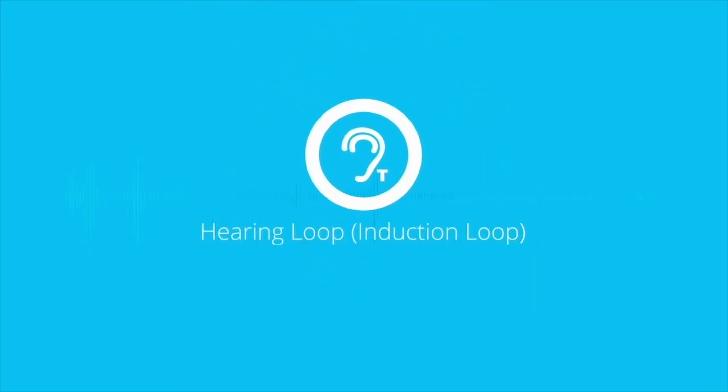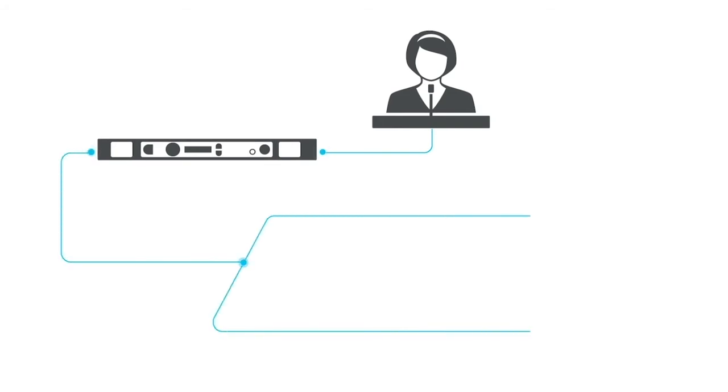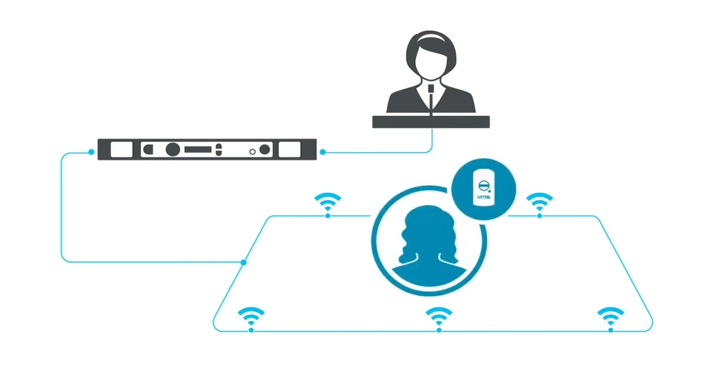Induction Loop, also called Hearing Loop, is a technology that dates back to the rotary phone, using a magnetic signal that travels through a loop of wire cable surrounding the perimeter, transmitting to anyone whose hearing aid includes a telecoil switch. It's important to note that induction loops only work with hearing aids equipped with a telecoil, a cochlear implant, or a receiver, and they don't work for every environment because of challenges with the physical building structure and design, as well as high installation costs.